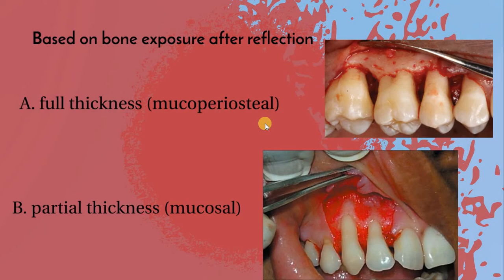So part of it with the periosteum remains on the tooth surface and on the bone. So in these cases, it depends on the type of exposure.